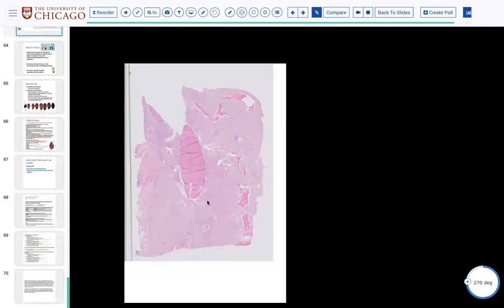I guess for frozens in general, the head and neck attendings seem very understanding of things taking a while. So I always get nervous, like, oh, it's taking too long. But I suppose they're all very well aware that these kinds of investigations are going to eat up a lot of time. I guess we should not stress about time when quality is at stake. I guess I need a little reassurance. I mean, I think time is obviously acceptable.